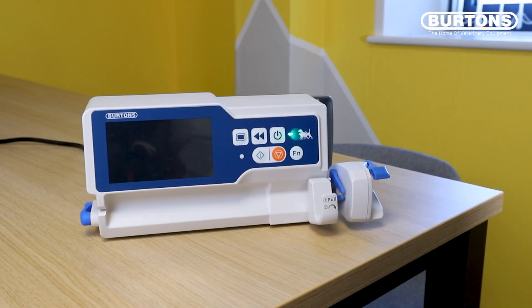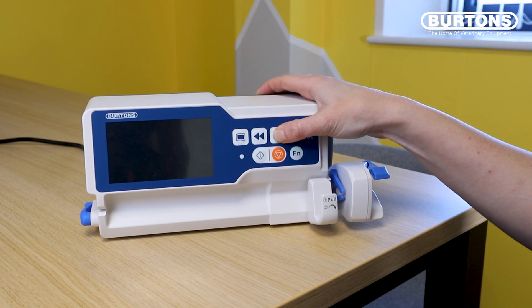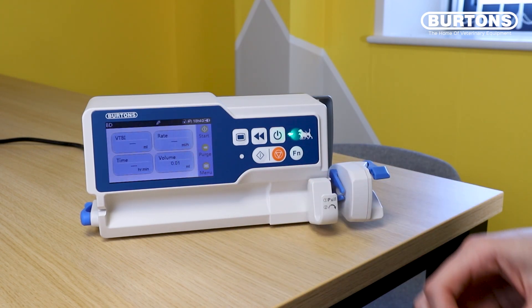To start using the syringe driver just hold down the on/off button until the screen turns on and it makes a beeping sound. Straight away it will ask you if you want to use any of the settings that were last loaded onto the machine. In this instance I'm going to hit no and then you land on this working screen here.